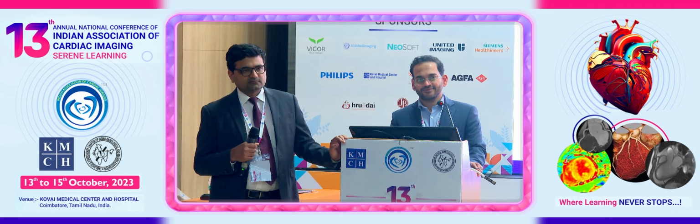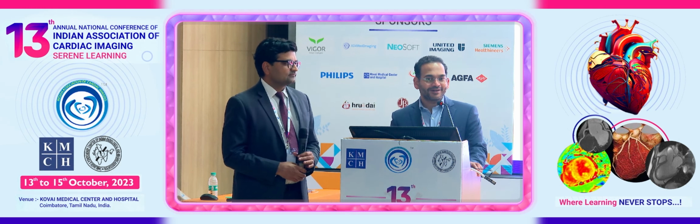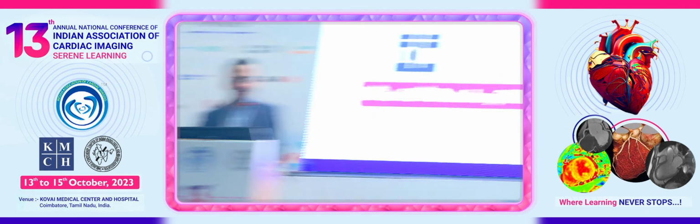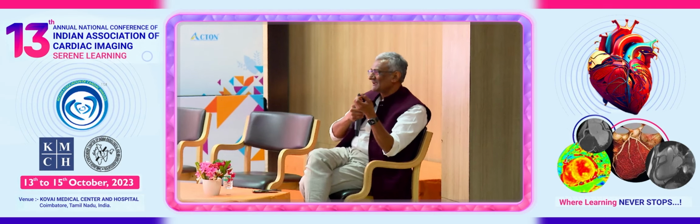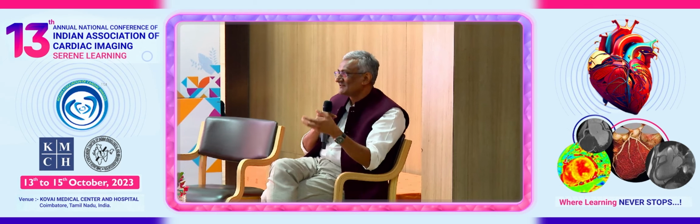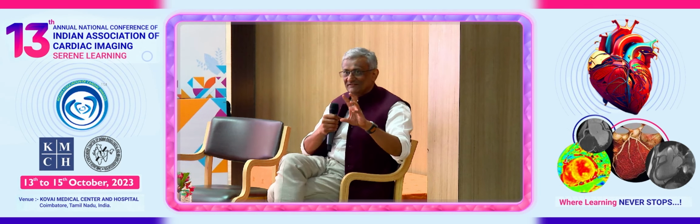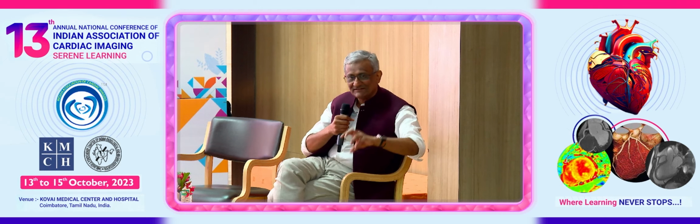It's even more complicated. Athletes have high calcium scores, but do they have disease? No. Do you put them on statins? No, because they are otherwise fit. It's not easy. All I'm trying to say is there is a movement that says calcium score can risk stratify.